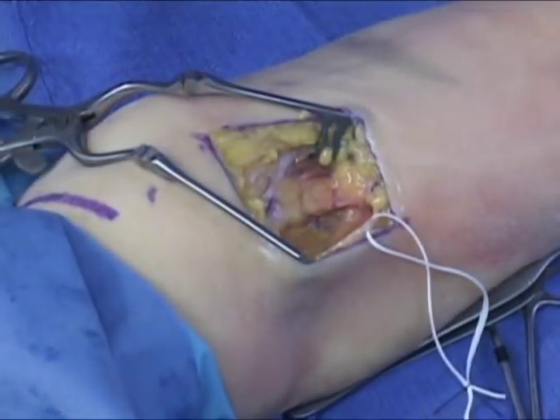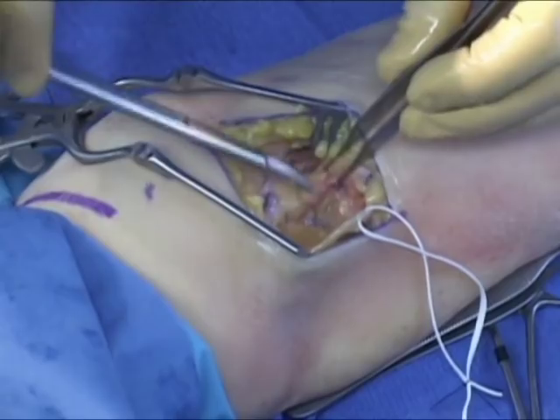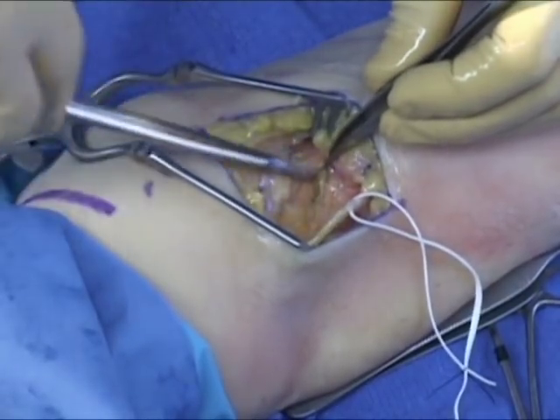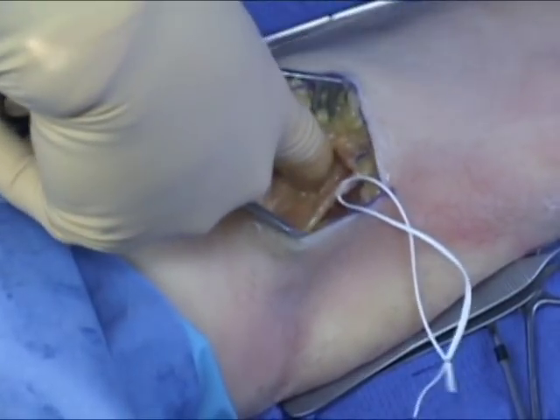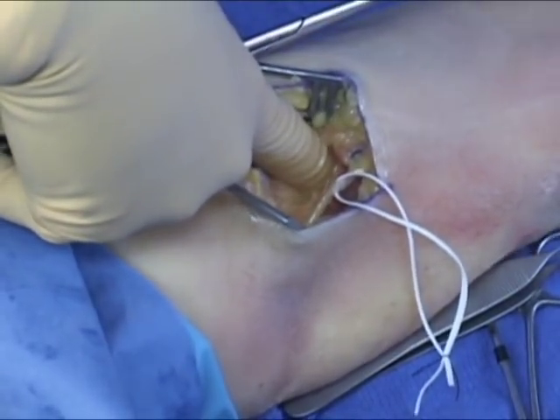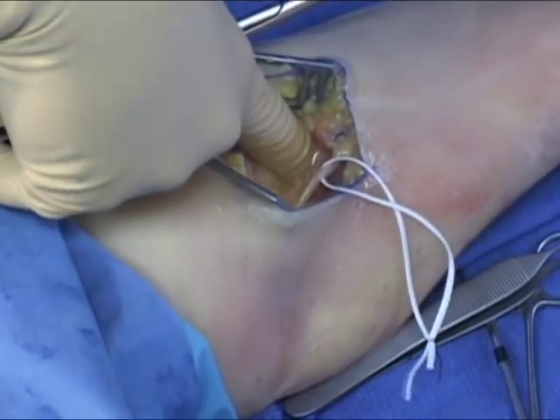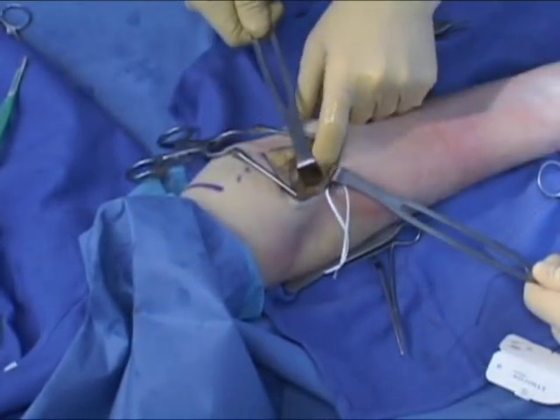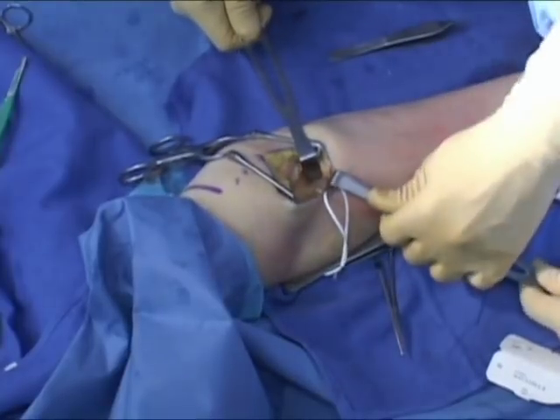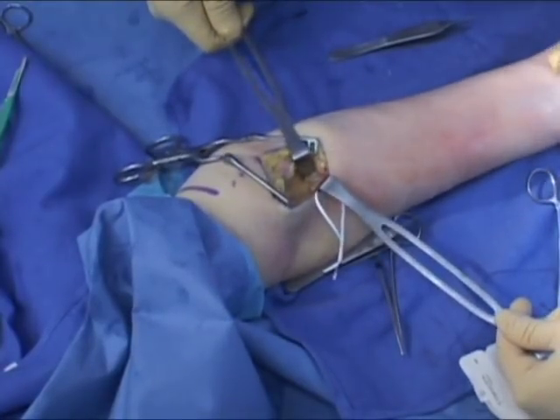The nerve is then carefully retracted to the opposite side while dissection is carried out lateral to the brachial artery in the flexor pronator groove to identify the biceps tendon tunnel. In acute situations, the tunnel can easily and bluntly be separated from surrounding soft tissue, leading the examining finger directly to the biceps tuberosity. With supination and pronation of the forearm, the biceps tuberosity can be confirmed.